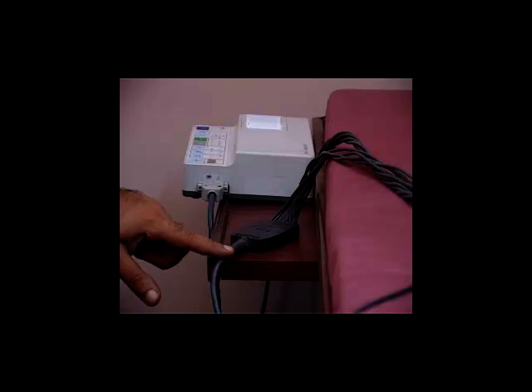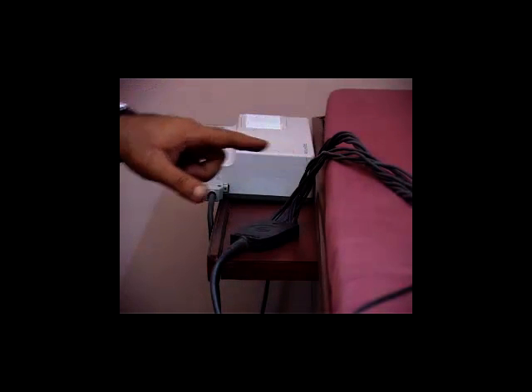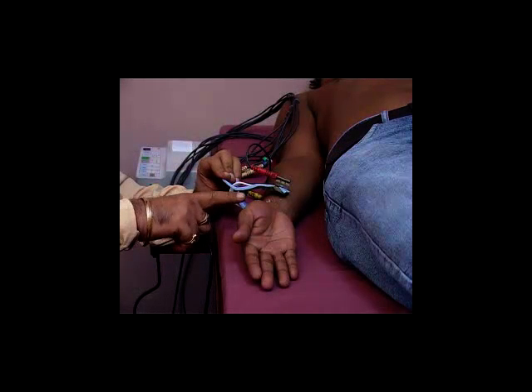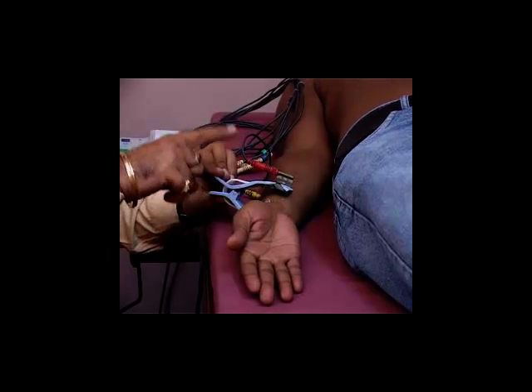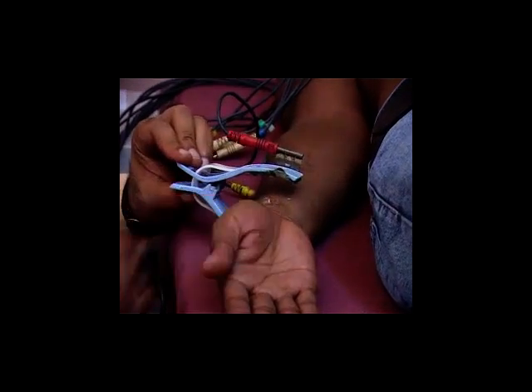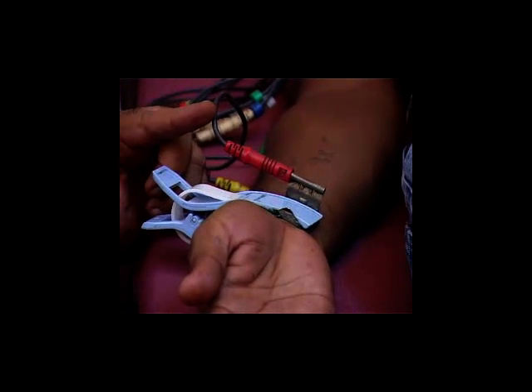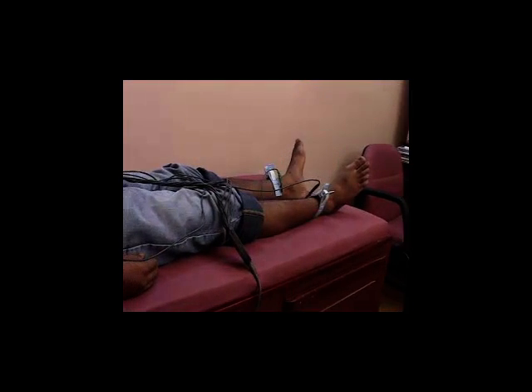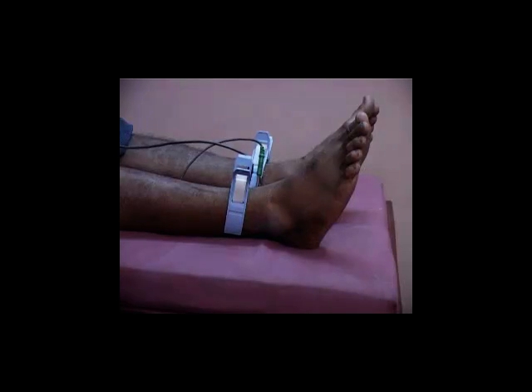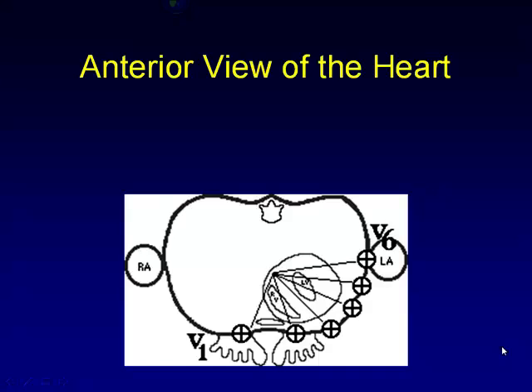A single lead from the junction box connects all the 10 electrodes to the socket in the ECG machine. The part to which the electrode has to be placed is first smeared with ECG jelly. This maintains good electrical contact between the skin and the recording electrode. The patient is now ready for his ECG. The 4 limb electrodes and the 6 chest electrodes are in position.